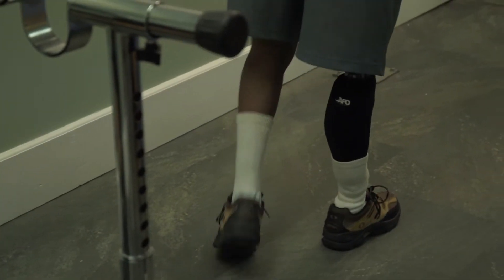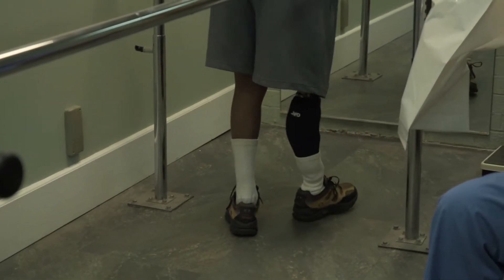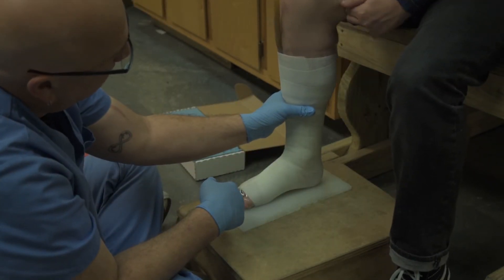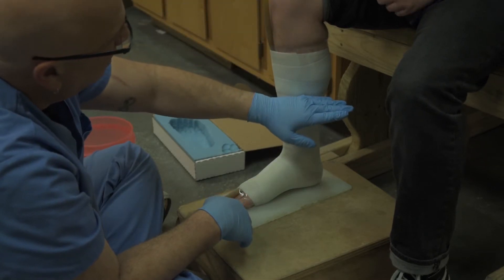A patient will come in from the doctor's office from a referral source, and they're typically an amputee. I'll do an assessment of how functional they are, if they can stand on one leg, if they're cognizant enough to put the leg on. I'll take a cast of their limb and then go through the process of determining what kind of foot they get, or if it's an above-the-knee amputation, what kind of knee they get.